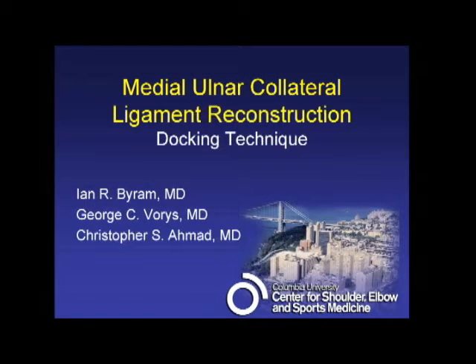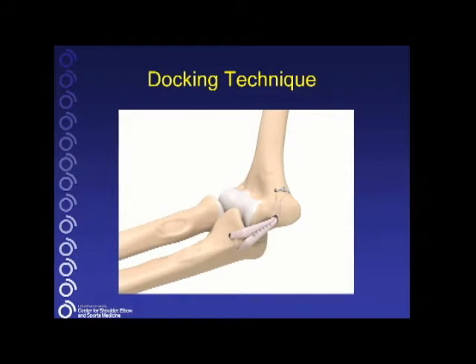I'm Christopher Ahmad, and this is a technique that demonstrates medial ulnar collateral ligament reconstruction using the docking technique. I'd like to thank Ian Byram and Chris Voorhees, who helped with this demonstration.